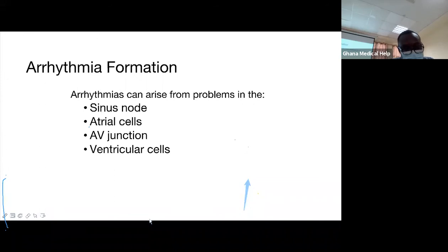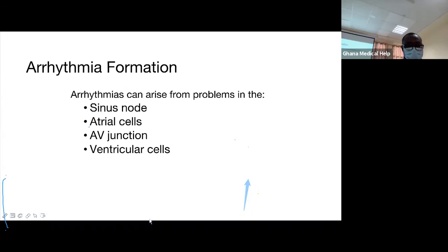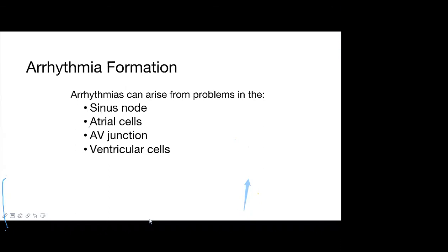Bismarck, your line is terrible. After the QRS, they talked about it. So if you can see. Yes, but the other wave after the QRS, you never said anything about it. Yeah, so we'll look at that. That's the T wave. All right.